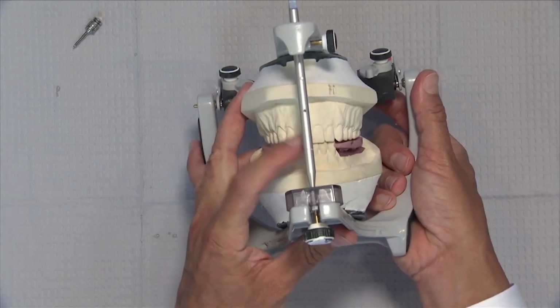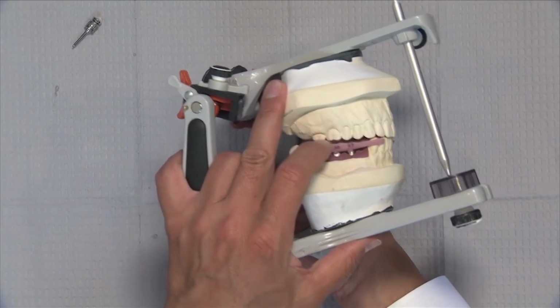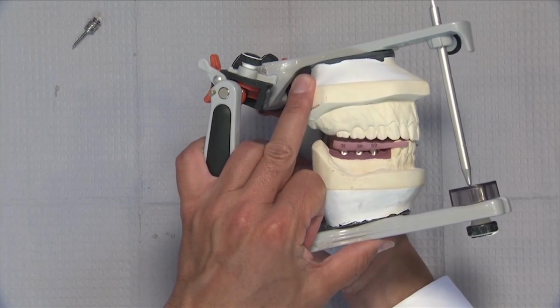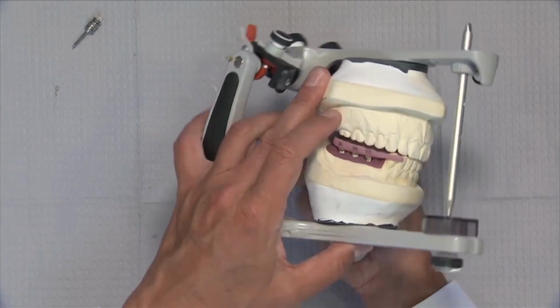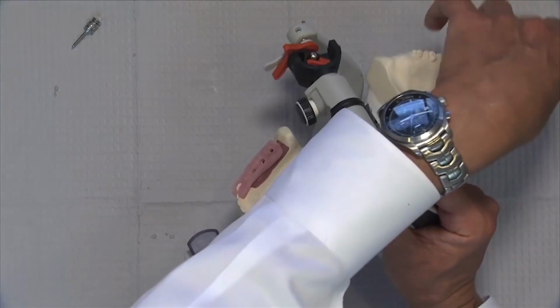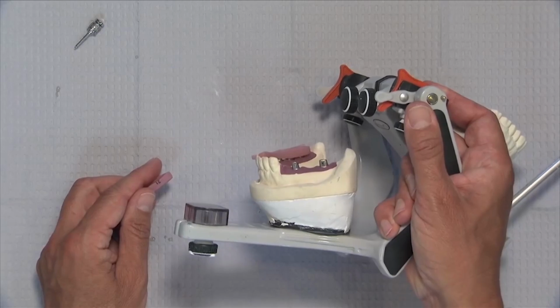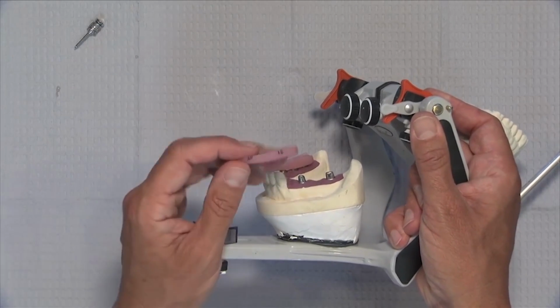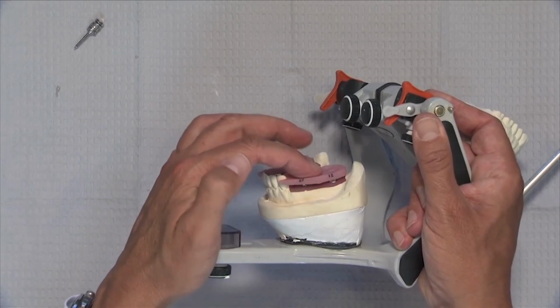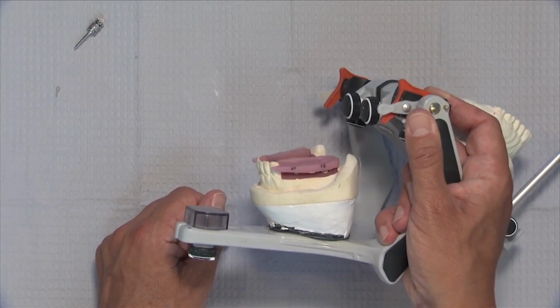Again, make sure that these anterior teeth are contacting in their proper positions with the two bite indexes in place, so that the patient is coming together the right way now, because in just a minute we're going to flow our bite registration material in there. So again, it's a great use in conjunction with the custom abutments. Now if you were using stock abutments here, you wouldn't have something like this. You could fabricate it in your office and make something like this that would attach onto the stock abutments and take the bite the same way if you're willing to go through that.